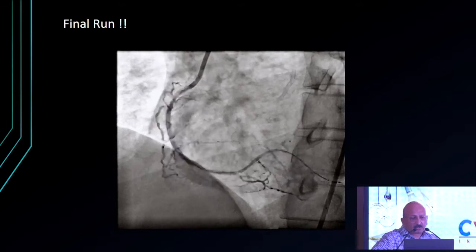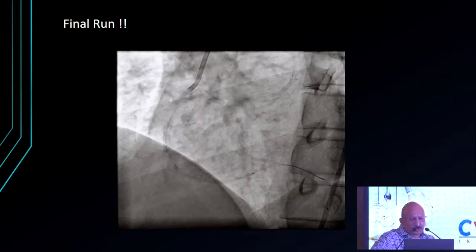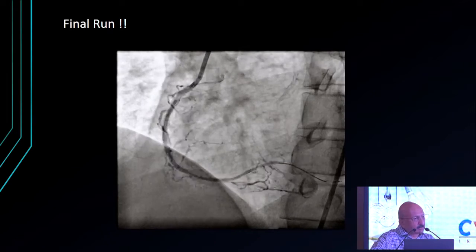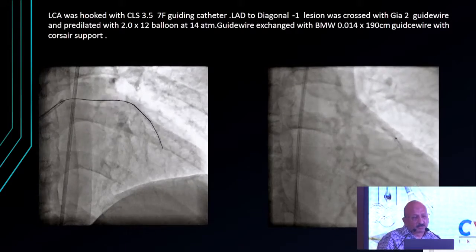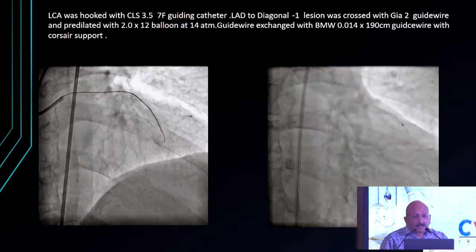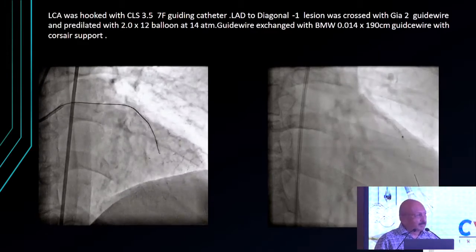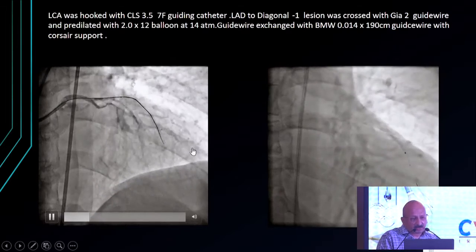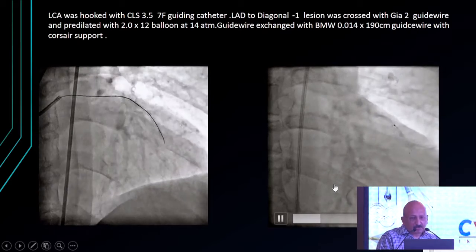So this patient's artery was looking like almost a stent-like result, I must say. There was no major dissection, no flow-limiting dissection, and we left it with 3 drug-eluting balloons and cutting balloon and laser, getting good results. And this is one of the strategies which we use very commonly these days. The LAD in the same patient was also badly diseased, and you can see there was a large septal which was coming out. And this vessel was crossed with a specialty wire, and after that, we started dilating it.